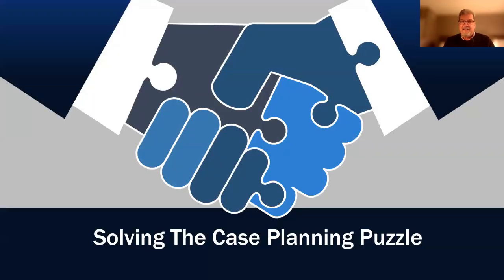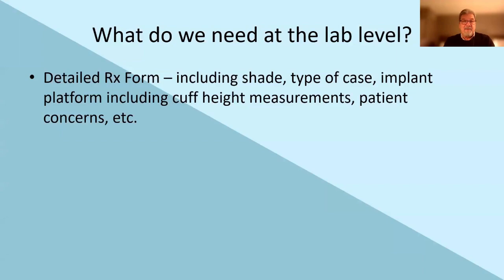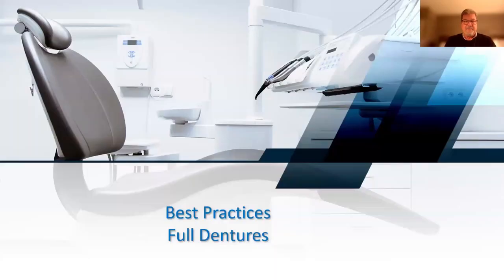So let's solve the case planning puzzle, and that can be solved with, like I mentioned before, information from you at the dental office and at the lab level. We need all the information we need to make a successful denture. So let's start in here with some of the basics. Best practices on full dentures.